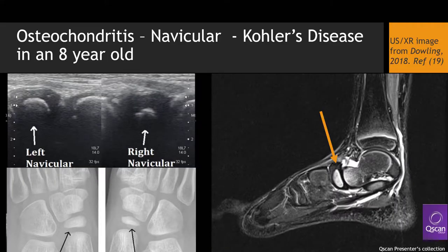You start on the dorsal foot and you compare the navicular bones, hoping to find Kohler's disease. That's an osteochondrosis that can cause young patients to have these small, underdeveloped, mal-shaped navicular bones. But sadly, your case, not that exciting.